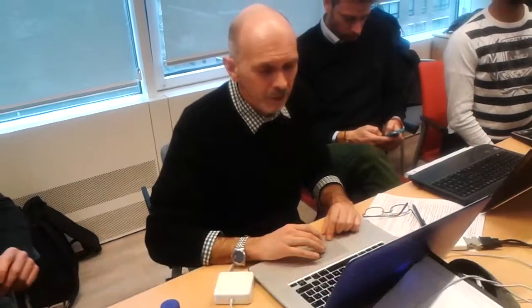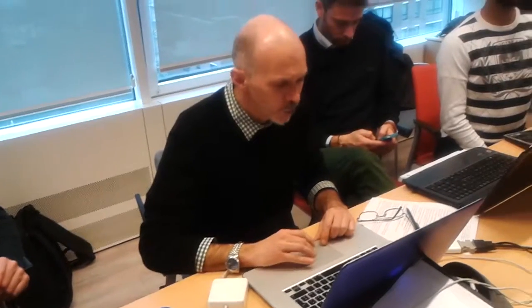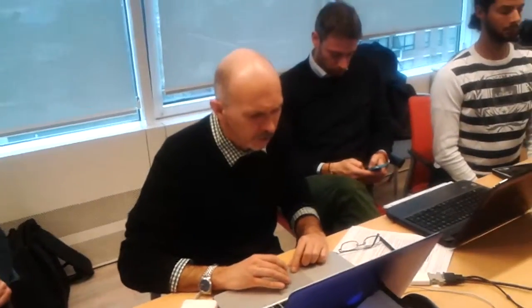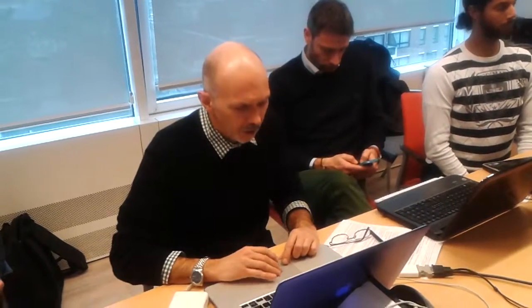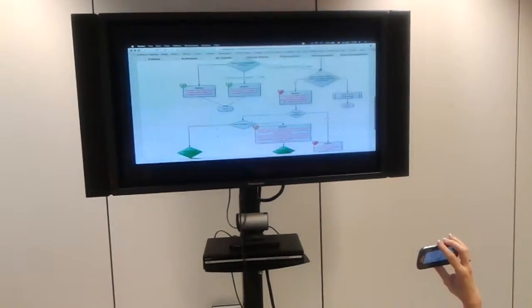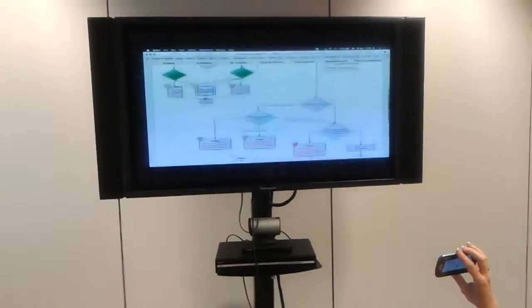As a side observation, we may check twice the guideline here for the cardioversion. We may choose different options and look whether everything is correct as it is in this case.